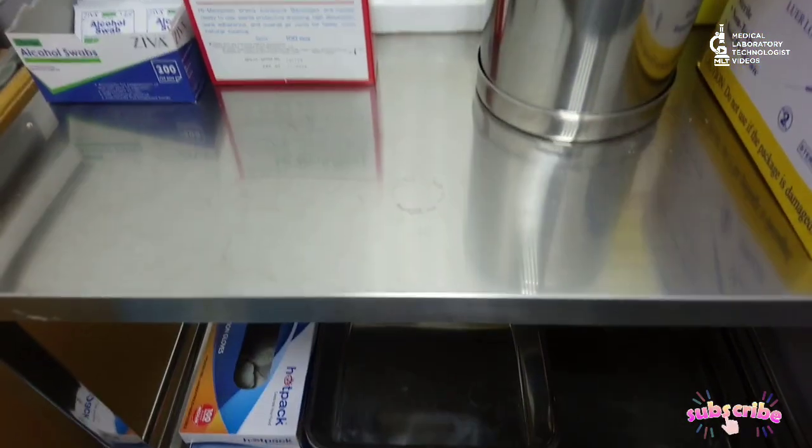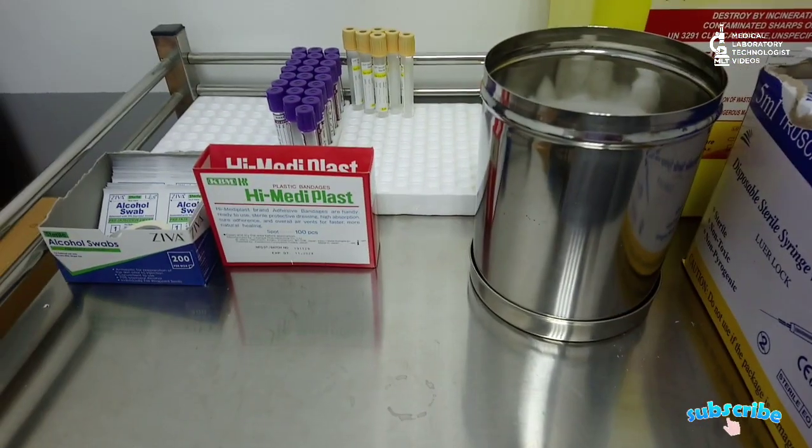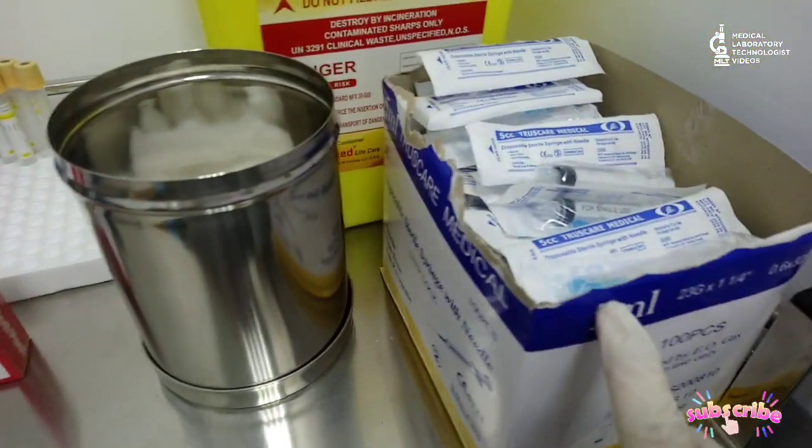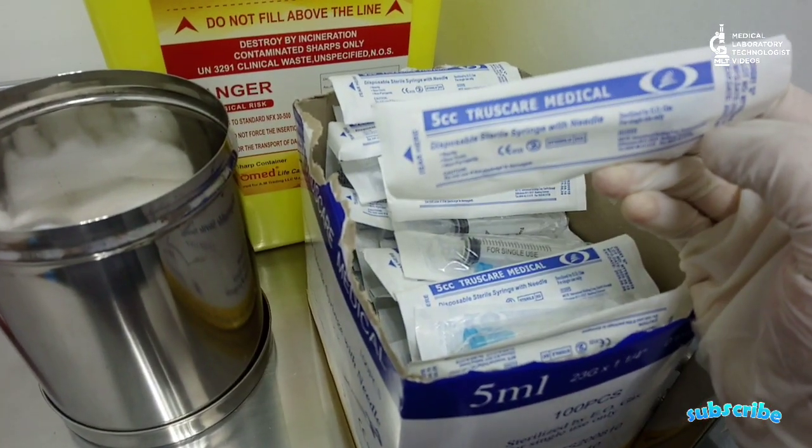Welcome back, friends. Today I will show you how to take blood samples in a safe and effective way, and the two points you have to keep in mind during sampling to avoid or give less pain to the patient.